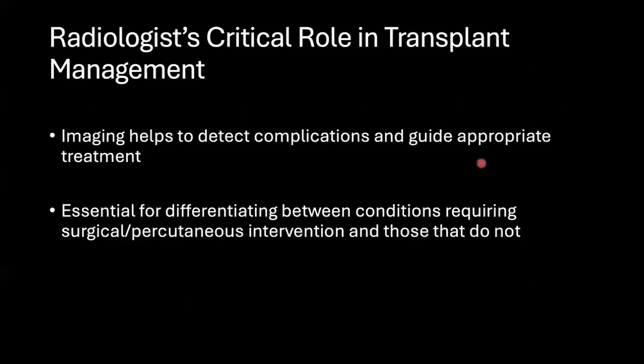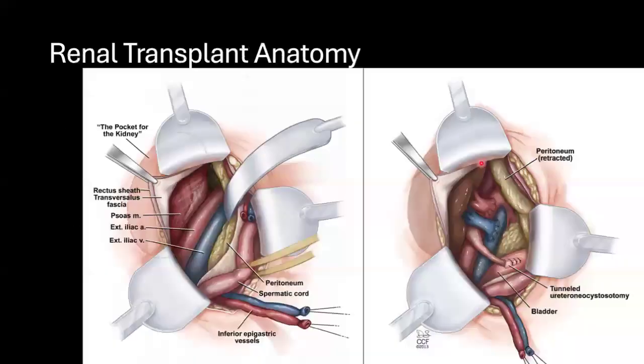And in imaging, we help detect the complications and guide the appropriate treatment. It's essential to differentiate between the post-operative complications because surgical or percutaneous interventions may be indicated in many cases, for example, if you have a pseudoaneurysm or if you're dealing with an infection.